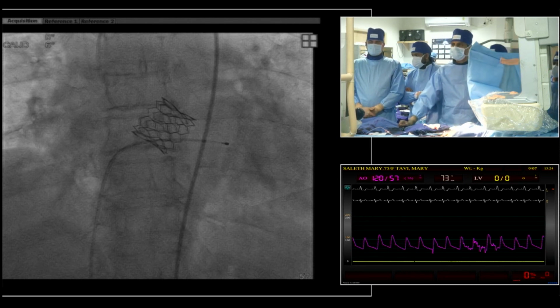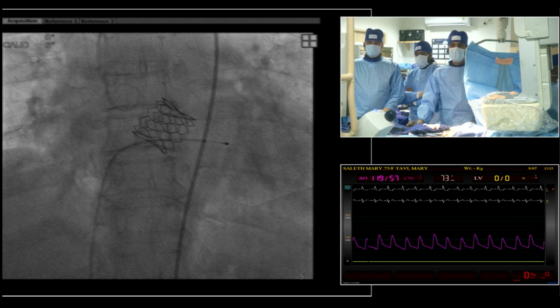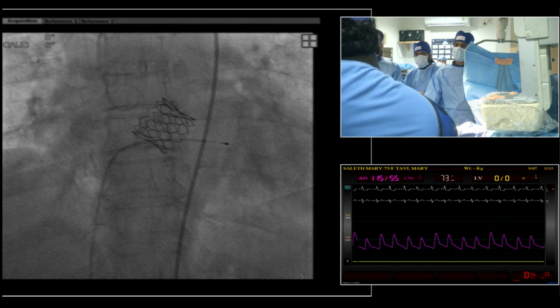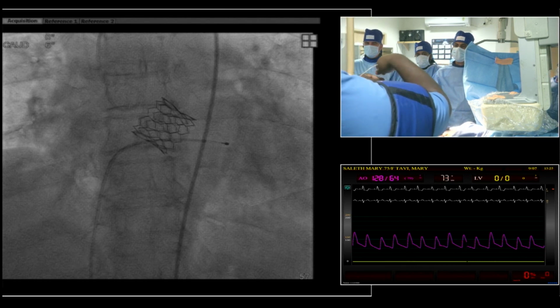So what we do in my lab is that the patient goes to the waking room for 1 hour, and we redo the EKG 1 hour later. Usually the QRS width is smaller, and sometimes it's the opposite. So sometimes we put a pacemaker before the patient leaves the room. But in this case, 140, I think, yeah, it's okay.